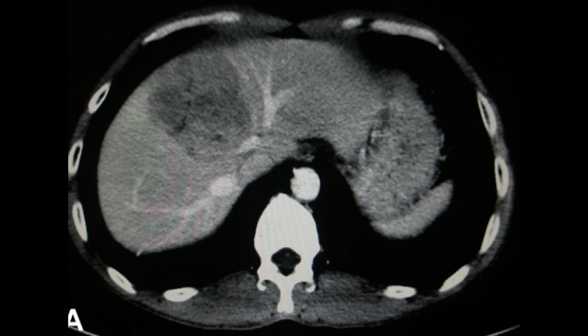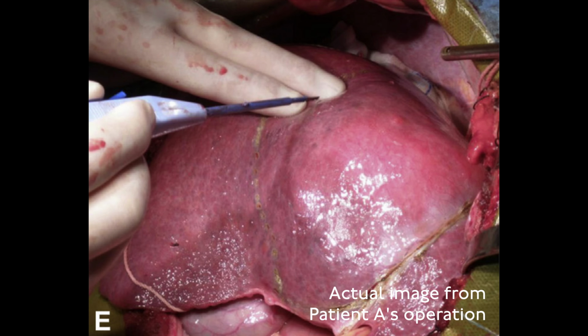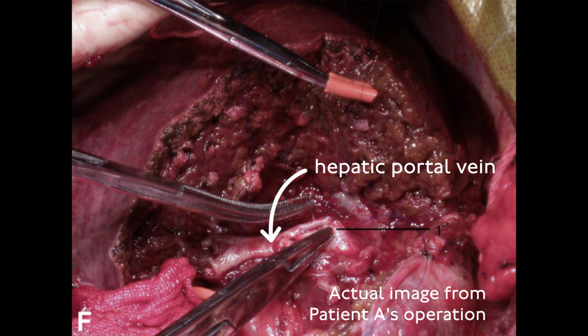How we use it at the moment, we most likely liaise on the imaging such as CT scan, MRI, or any imaging that we have, and there's a kind of software that is being used to reconstruct the anatomy of the patient, and then it will guide you into the operation, how to do the operations and what to predict and what to avoid, and the anatomy and all the kind of aspects that you would like to know prior to carrying on and doing the procedure.